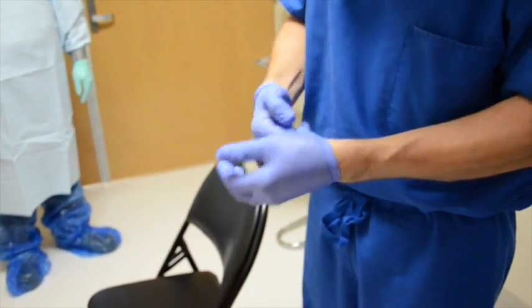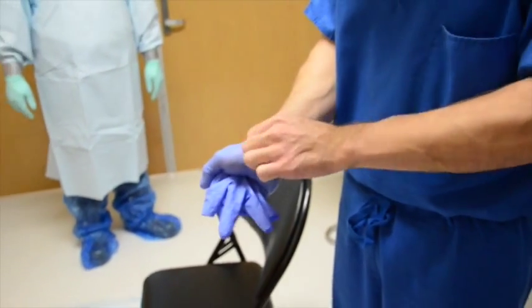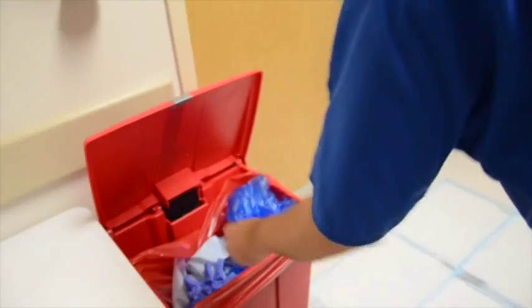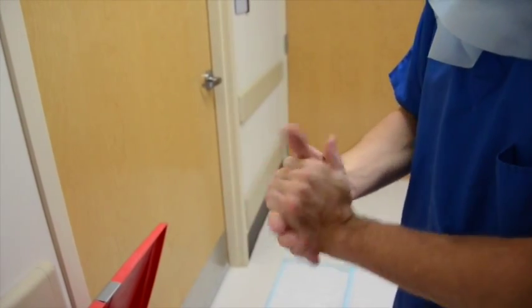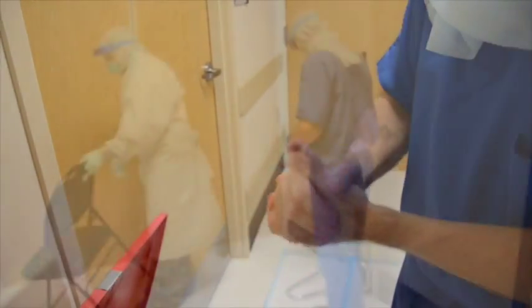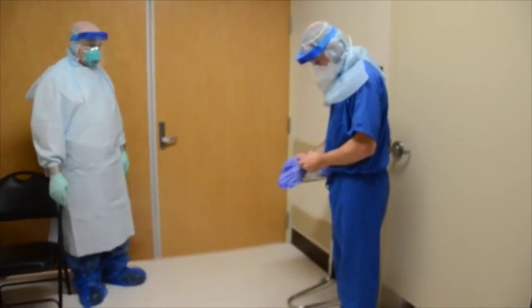Remove standard inner gloves using glove-in-glove technique and place in red bag waste container. Perform hand hygiene using sanitizer. Allow hand sanitizer to dry before applying new clean gloves. Apply clean nitrile gloves before removing any additional PPE.